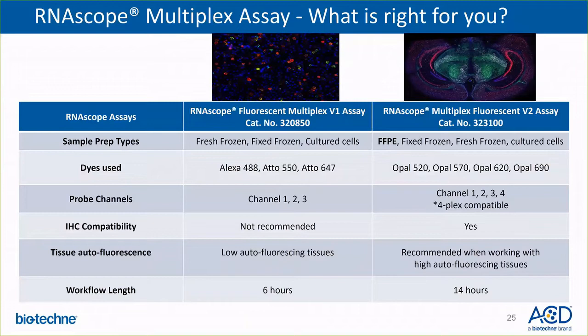The Leica Automated Multiplex Fluorescent assay is similar to the manual V2 assay. It also utilizes the TSA amplification system, but is fully automated and is compatible with FFPE and fresh frozen samples.